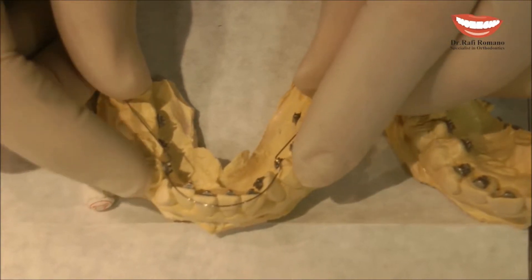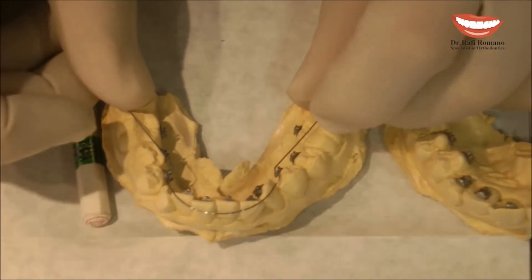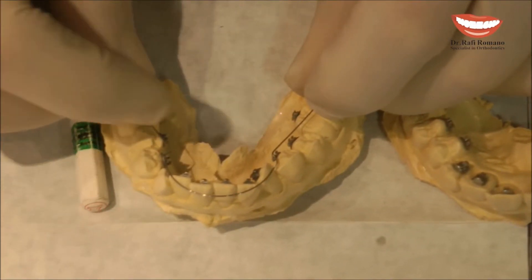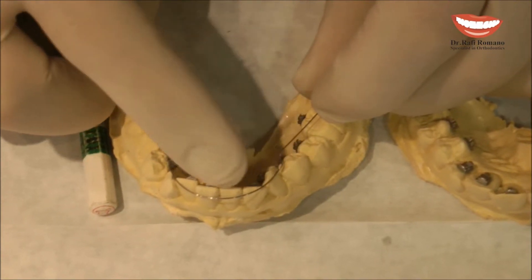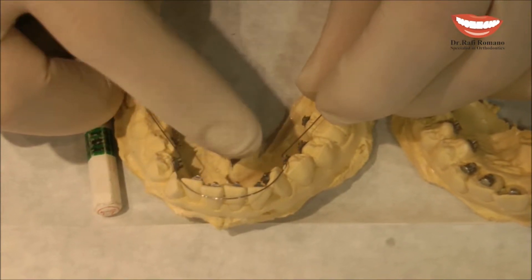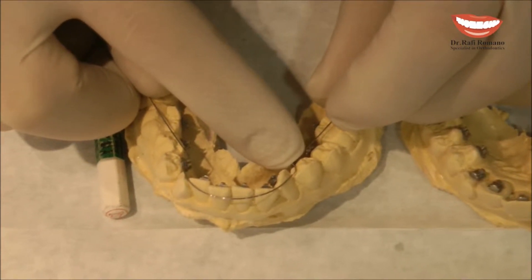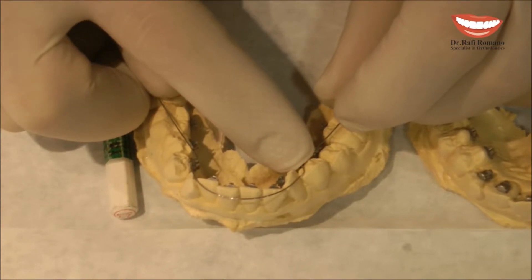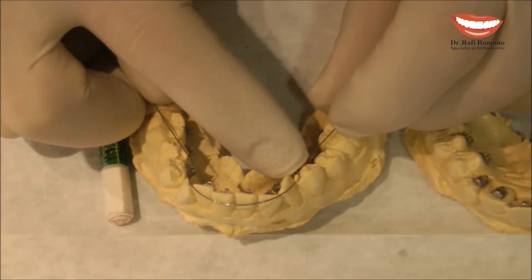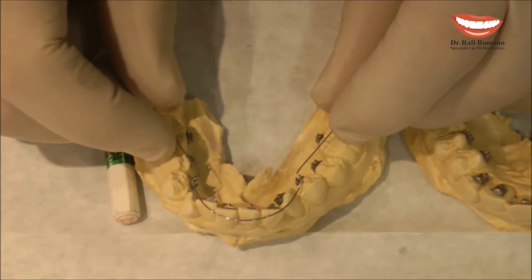Side effects can be rotation of the premolar, because the wire leans on this premolar. And I can get some exaggerated force on these centrals. Therefore, this bend is recommended to do on a very, very flexible wire, such as 0.012 or 0.014 nickel-titanium, which will give very minimal force.